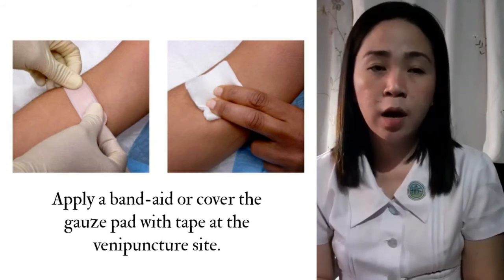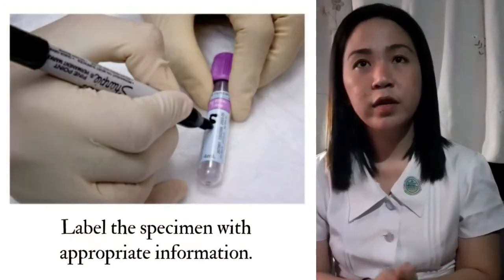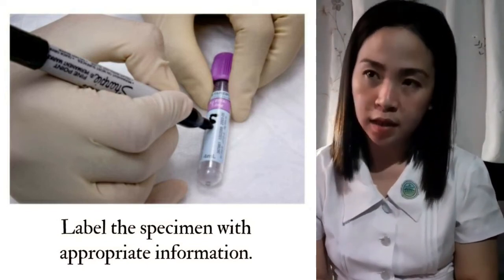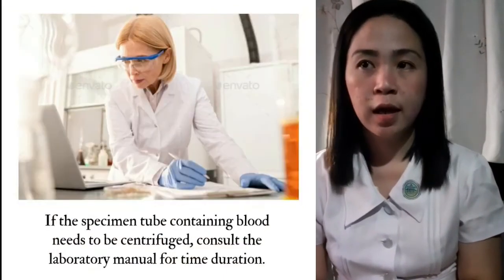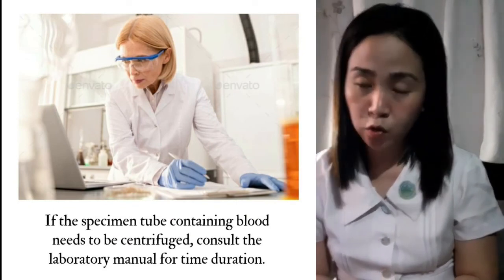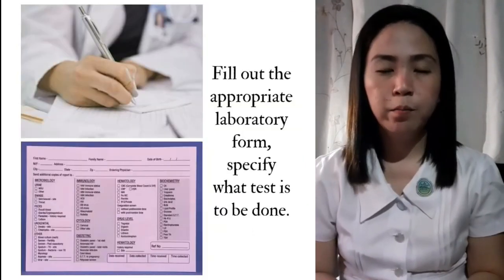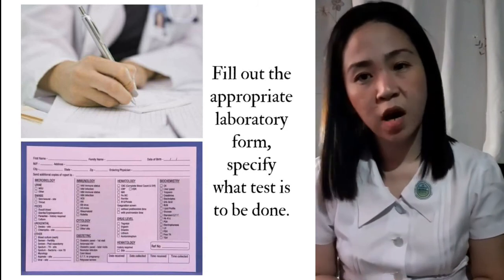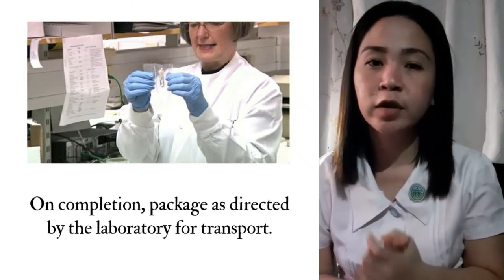Label the specimen with the appropriate information such as the client's name, date, time, ID number, and your initials. If the specimen tube containing blood needs to be centrifuged, consult the laboratory manual for the time duration. Fill out the appropriate laboratory form and specify what test is to be done. On completion, package as directed by the laboratory for transport.